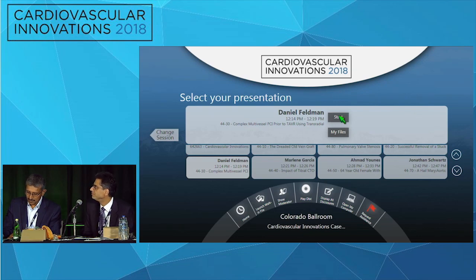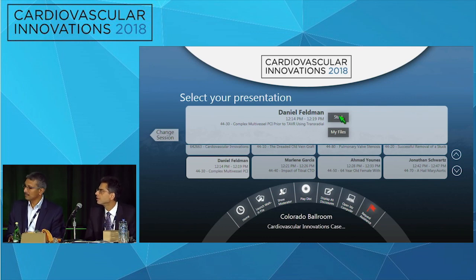That's a good question. I guess we probably would have gotten femoral access and tried to see if we could get in some sort of support. We could have tried with the balloon pump. Someone on Thursday when we presented mentioned just going up with a pigtail and leaving that in the LV in case you want to try to cross with an Impella. And if we couldn't do that, having not done that up front, maybe even just putting in a balloon pump and seeing if that would help, although probably wouldn't help too much.